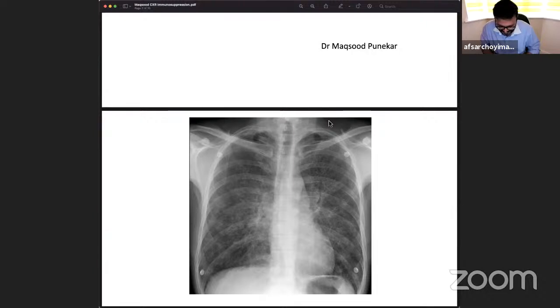I can understand, but it depends on what question you are putting forward. If you're suspecting a lung malignancy, then there's no point in spending time on a lateral X-ray. You need to do the next investigation, something more definitive, more conclusive. That's the reason why most of the time we say there's no point in wasting time on a lateral X-ray. Go for CT. Or if the radiologist can confidently tell you that what you're looking for is not there on the PA, you won't see it on the lateral X-ray either.